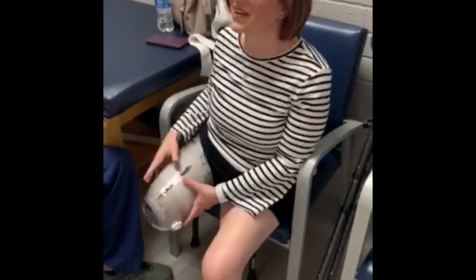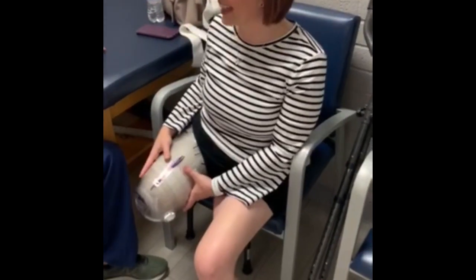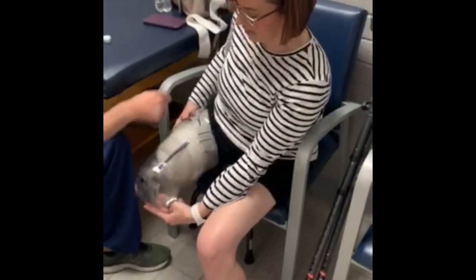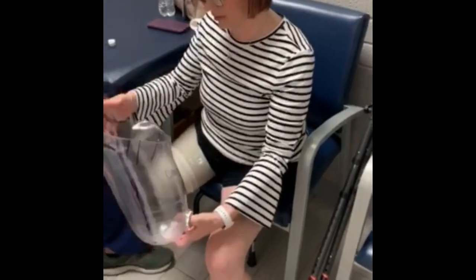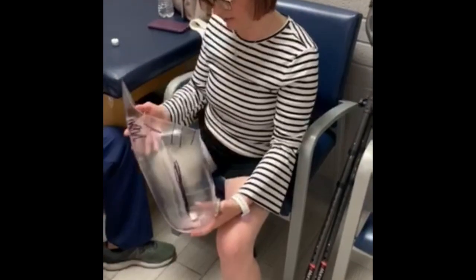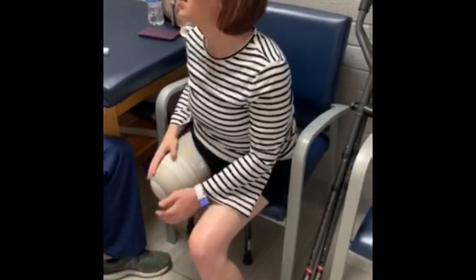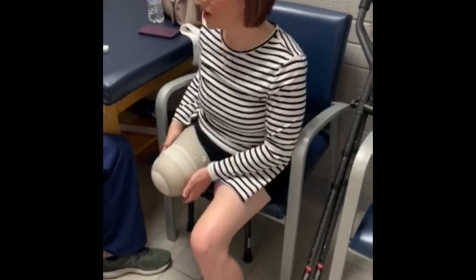Oh wow, that's so weird. Where's the vacuum? Yeah. And so what you can do, stick your thumb in there, just use it as a hook. Sometimes it gets to where all of our alcohol didn't evaporate, but it will eventually. Yeah, right. It mainly didn't evaporate because there was a void down here. Your body temperature gets close to that, it evaporates real quick. Okay.